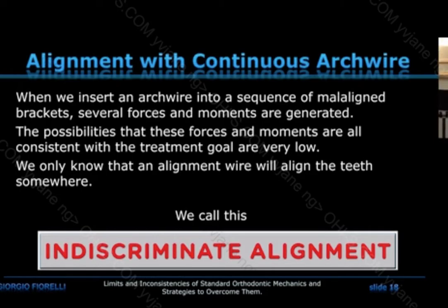One of the things that it's very important to say is that doctors are always used to start, 90% of doctors worldwide work with straight wire.